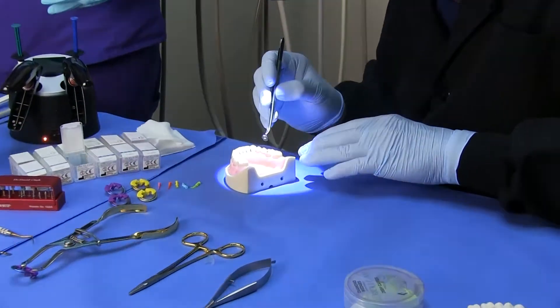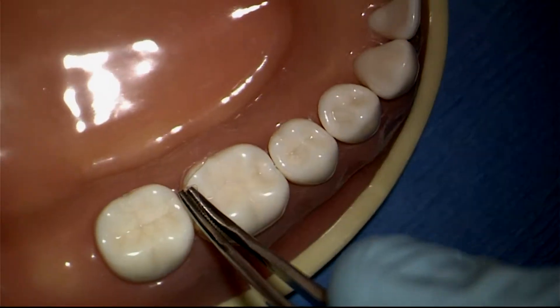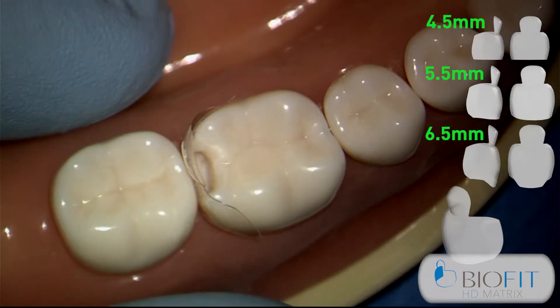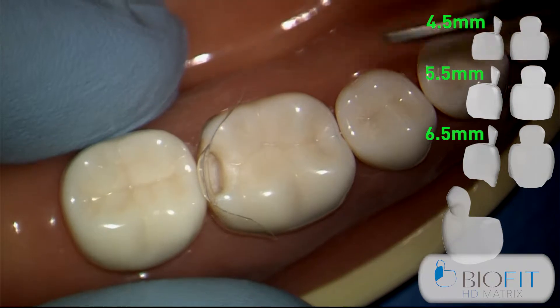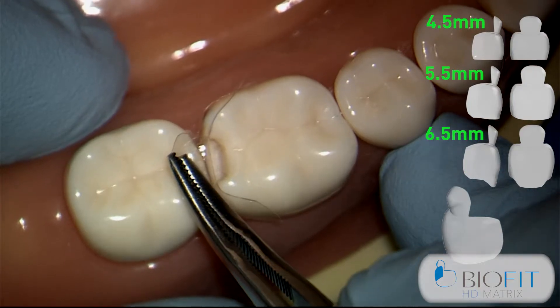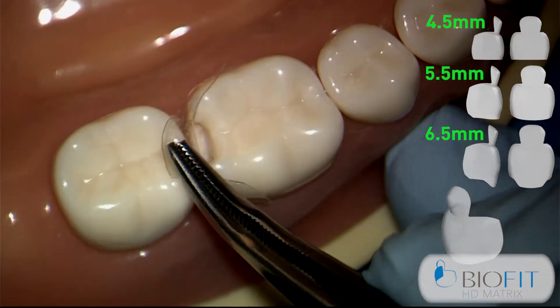What you're going to notice with the new Bioclear posterior matrix is it has a tremendous anatomical shape and there are some new features I hope you really enjoy. Now we need to make sure that the tab is centered over where the restoration is going to be placed. This is a great advantage because we're going to fold this tab down, and this will disallow any composite from going on the wrong side of the matrix.